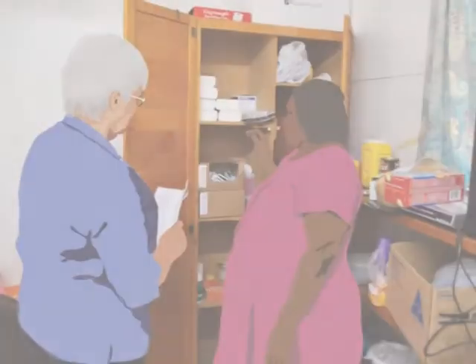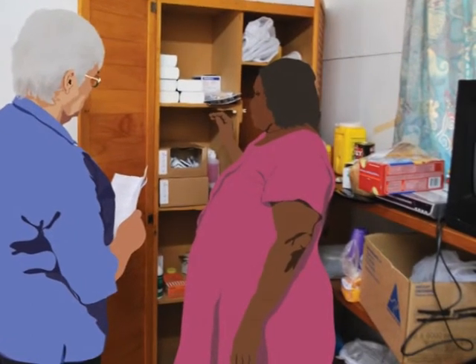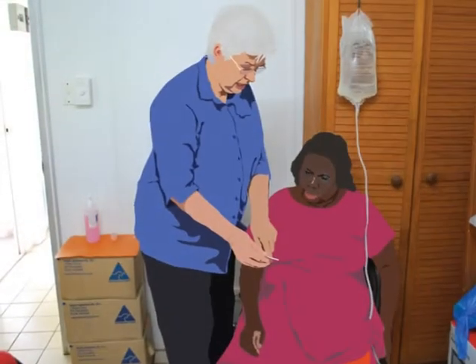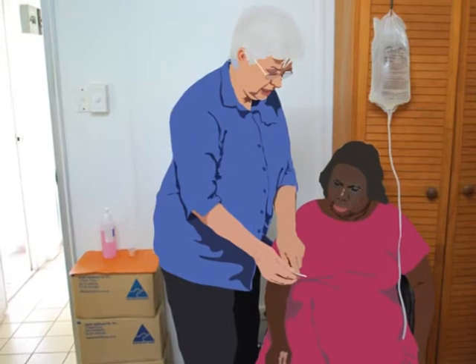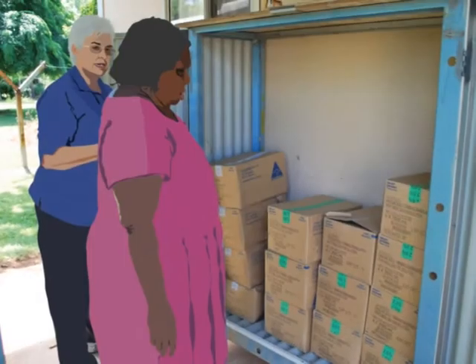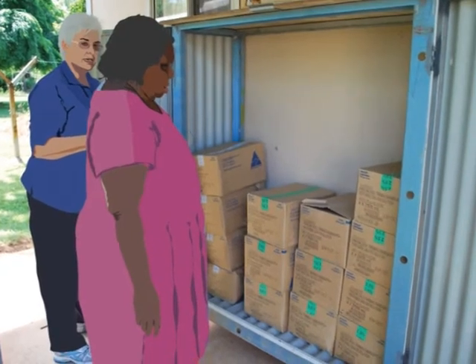They will train you and help you until you and your community are ready for you to do your PD from home. When you move back home, PD nurses will still visit you to help you. They will also teach you how to get more bags and how to look after your bags.